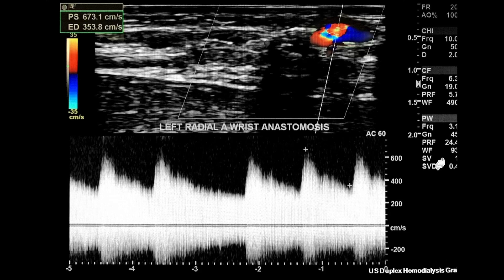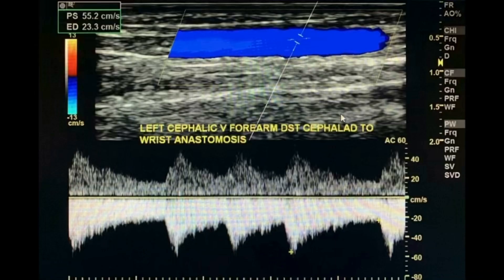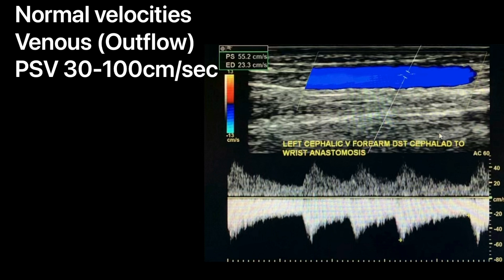In normally functioning grafts and fistulas, you're going to have a low-resistant monophasic waveform with increased diastolic flow. The flow may be a little turbulent with spectral broadening. Normal velocities on the arterial or inflow side range between 100 and 400 cm/s peak systolic velocity and 60 to 200 cm/s for end diastolic velocity. On the outflow or venous side, peak systolic velocities range from 30 to 100 cm/s. The further away from the graft or fistula, the lower the velocity and pulsatility.